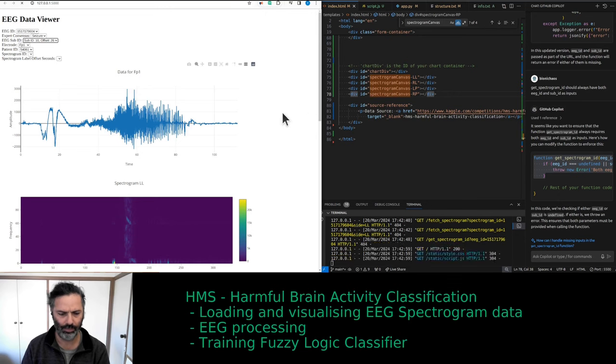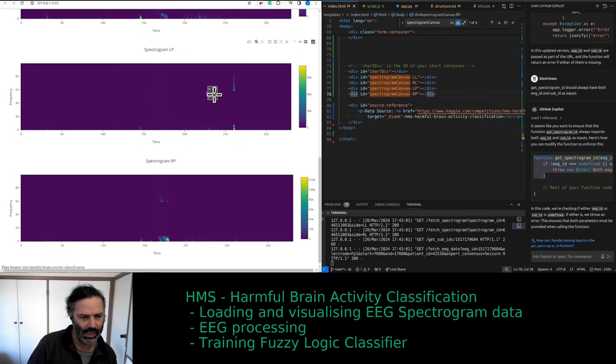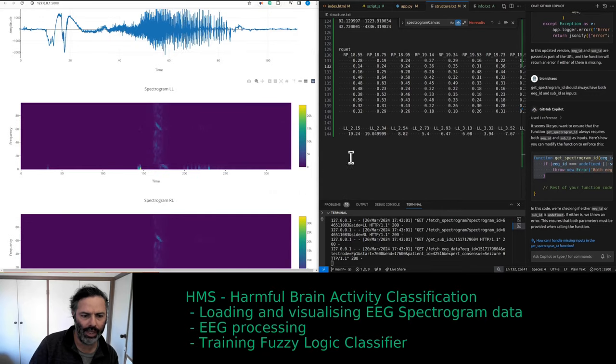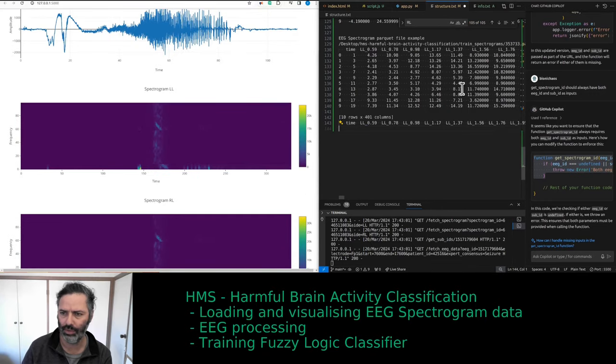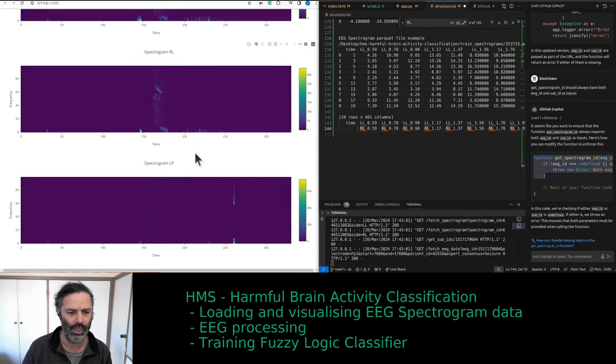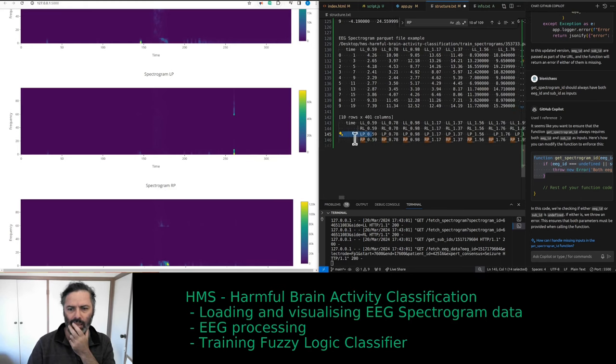Those charts are just scanning forever, are they? So there's something wrong. Those frequencies are not mapped correctly. That seemed to be the continuation of this. So we have LL, RL. Let's get rid of that for a sec. So we have time, RL, LP, and the RP. This is meant to be frequencies. Time ideally should be in a separate variable. I don't think it is at the moment.